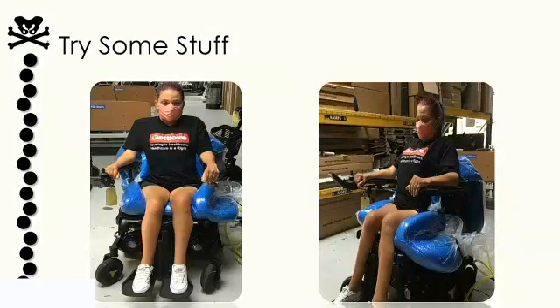And then whether it be custom molding or a manual chair configuration with the mat table, with your physical assessments on your mat table, and then with your determining of the orientation, we're going to try to simulate a system that is going to work okay. So build it, design it, figure it out, get your stuff, and just test. So just trial a few things. By the time the spinal asymmetry is pretty pronounced or significant, most of the time we're looking at a custom mold. So she's in a custom mold here, but it doesn't necessarily have to be. This could be configured seating as well.